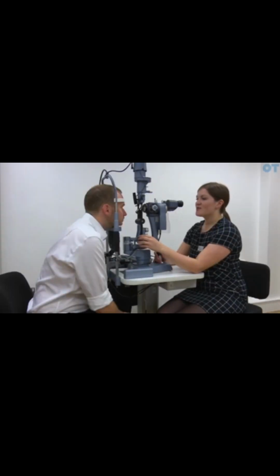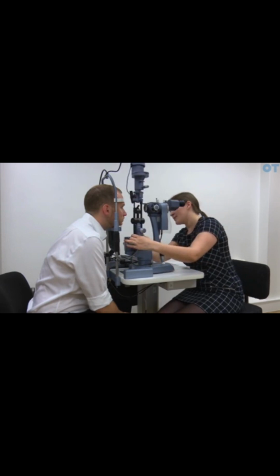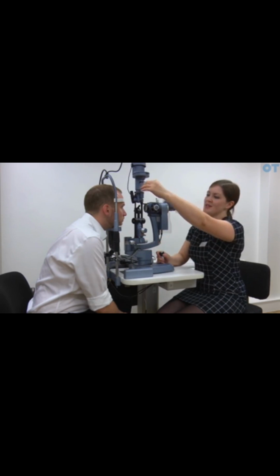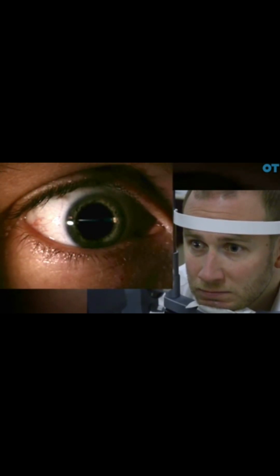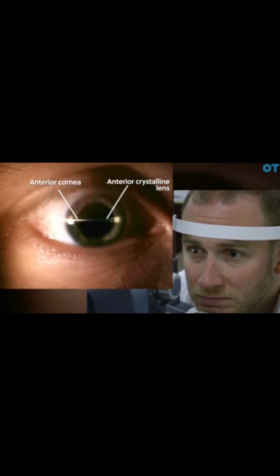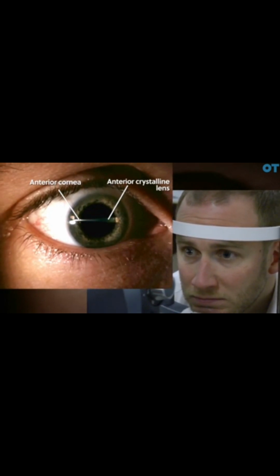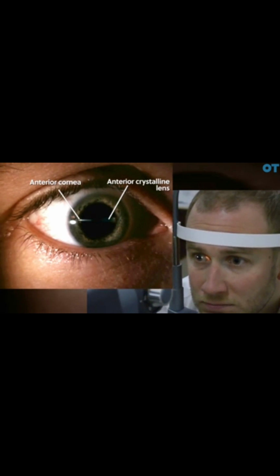So in order to perform Smith's technique, the observation and illumination systems must also be separated by 60 degrees, and the beam must be rotated so it is horizontal. Then what you will do is place the beam horizontally across the cornea. You start with a short beam and you will see a brighter beam which is placed on the anterior cornea, the epithelial surface, and then a duller image which is placed on the surface of the anterior crystalline lens.